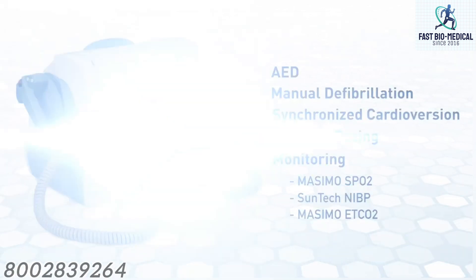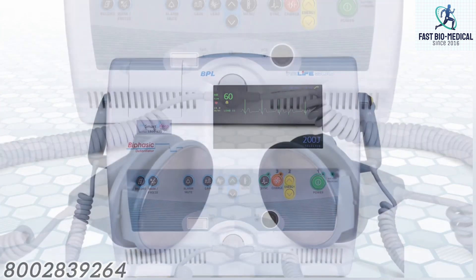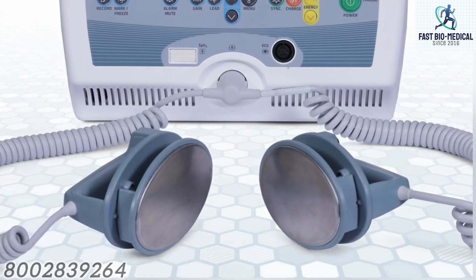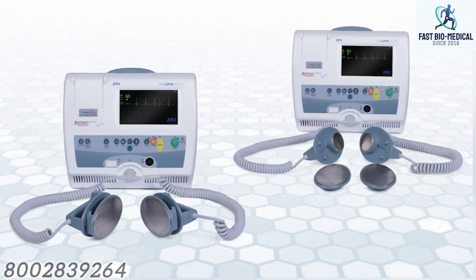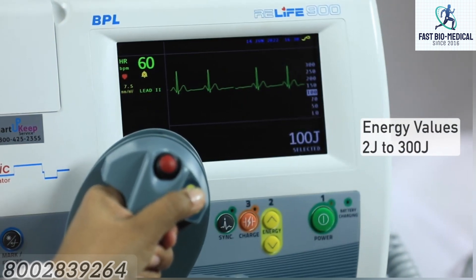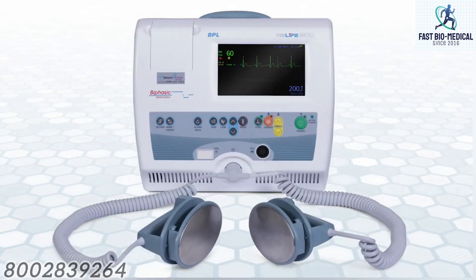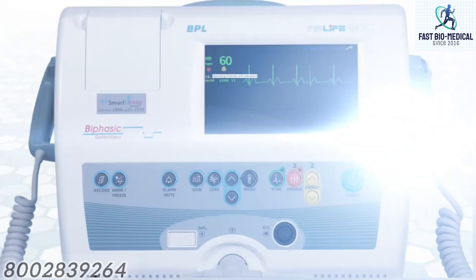The Real Life 900 defibrillator is equipped with external defibrillation paddles suitable for both adult and pediatric use. The user can select energy values from 2 joules to 300 joules. The defibrillator has a 7-inch color TFT display.